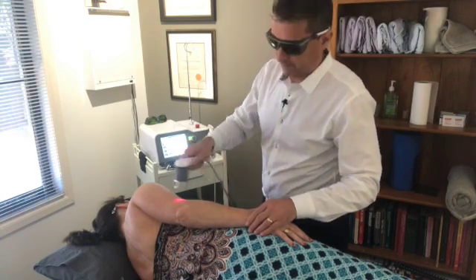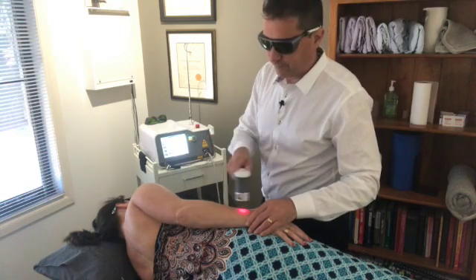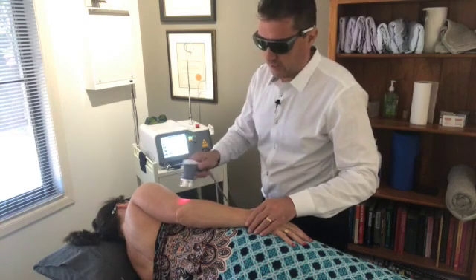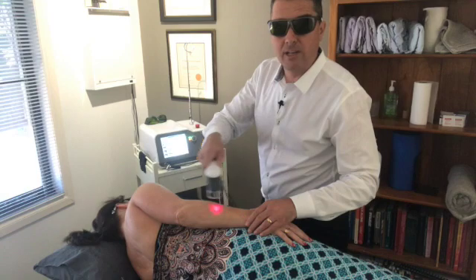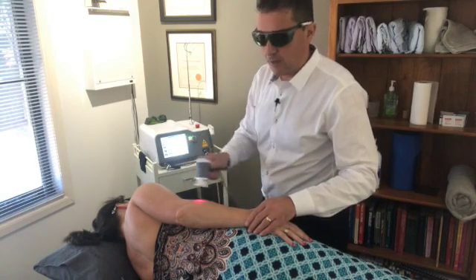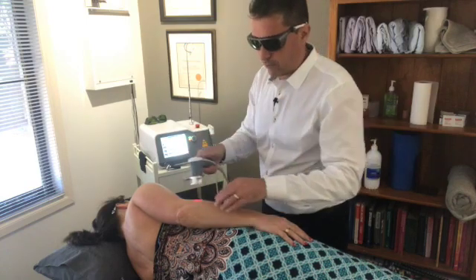Now we have this amazing tool — the high-intensity laser — which triggers tissue regeneration and speeds up your body's own healing of the tennis elbow. With tennis elbow, the problem is that all these muscles here that move the fingers come from this point right here.